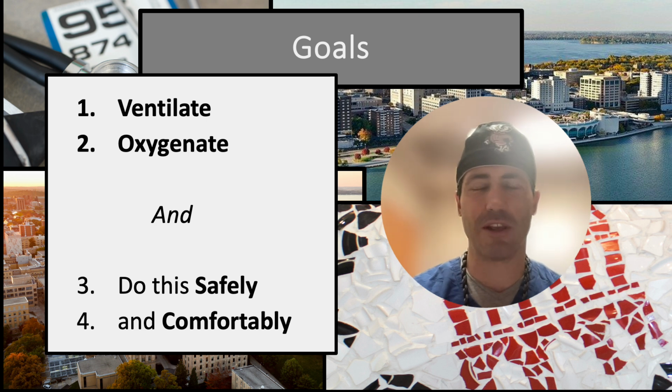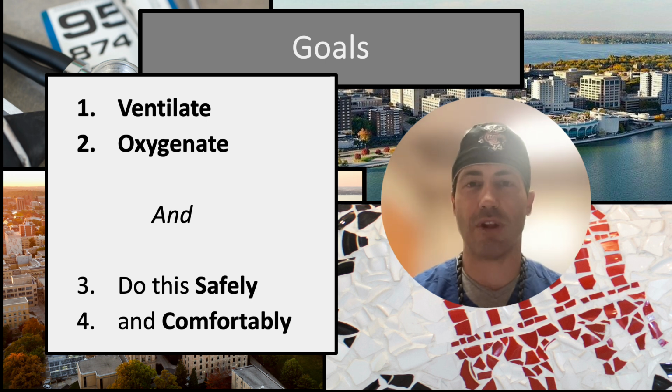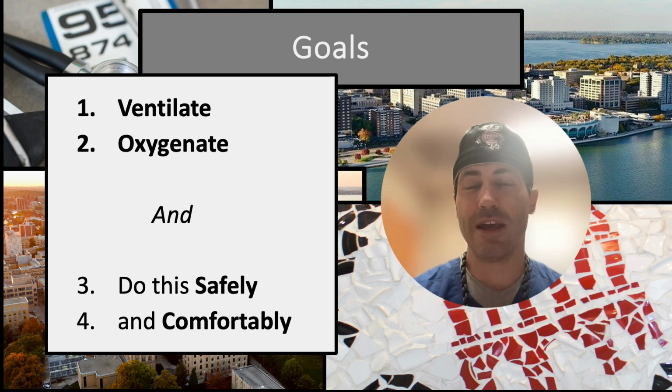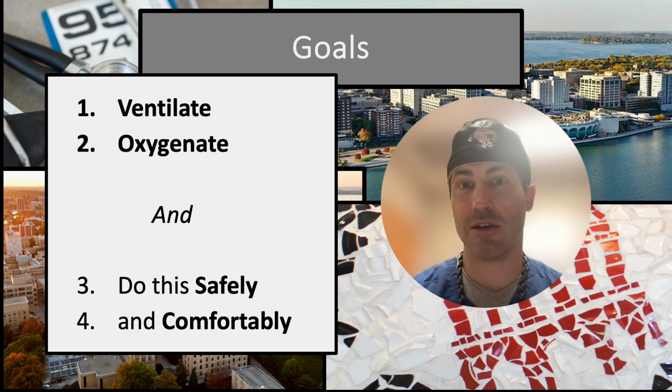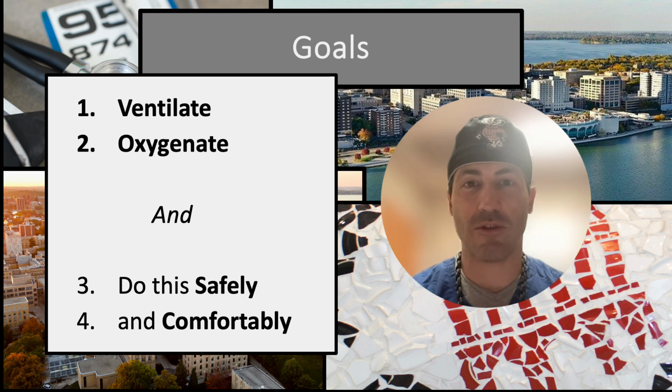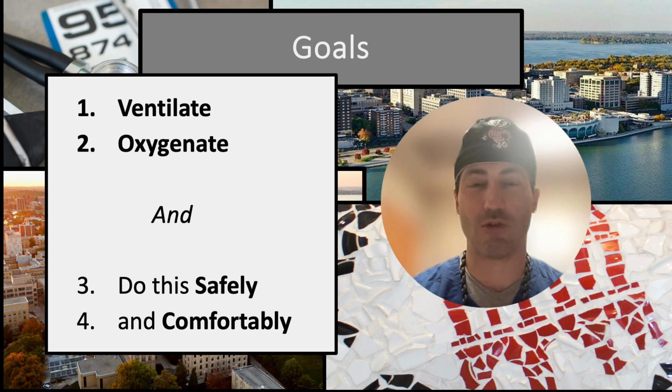This is important because if we screw up our ventilation, the patients are unable to really succeed at a spontaneous awakening trial and spontaneous breathing trial. So if you ventilate people well and comfortably, you can improve their outcomes with regards to their brain. You can decrease their risk of PTSD, and you can decrease the cognitive loss that happens in critical illness by picking ventilation strategies that are comfortable for the patient and let them get less sedation.